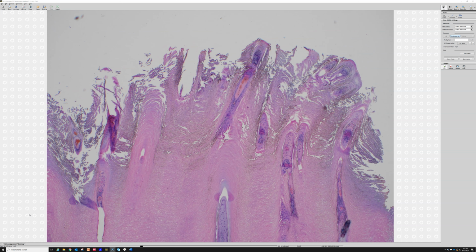I'll be like, well, this is probably the top of a wart, but I can only really see one little finger-shaped projection of keratinocytes. So what would I do in a case like this? Well, for one thing, it depends on if I've got a shave like this and it's from the foot of a 12-year-old kid, well, guess what? That's going to be a wart, right?